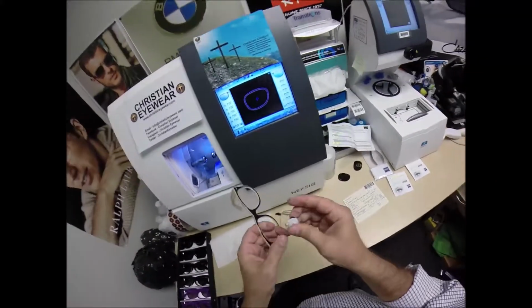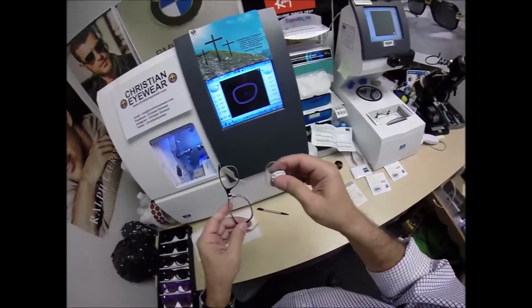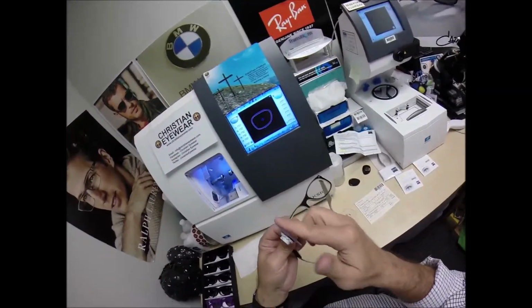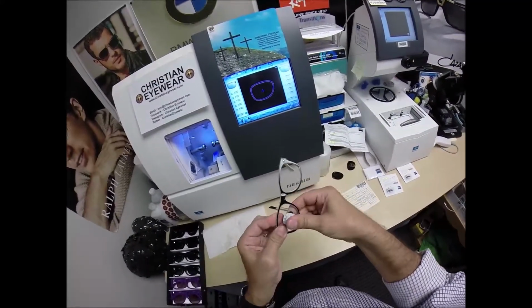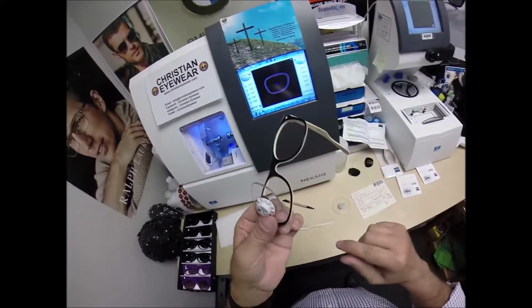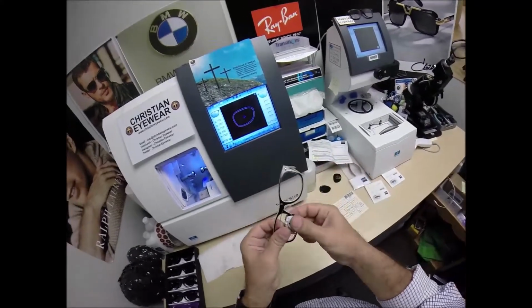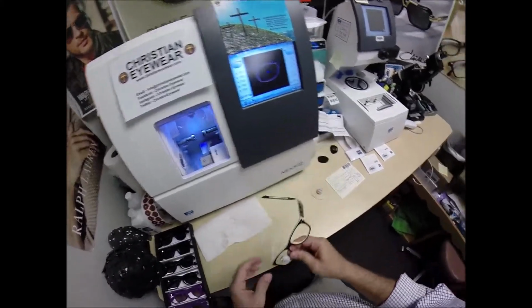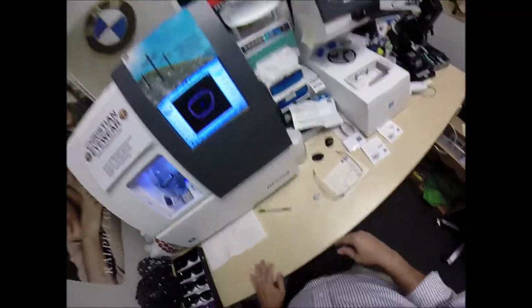Now, the reason why I put the safety bevel on the back surface of the lens: if this were too large, which I know it wasn't going to be, but on the 55 eye size it can be, I do not want any rough edges from the lenses coming in contact with the frame as I press down. If I felt it was too large, I don't want to scratch or mar the finish of the frame, so that's why I always put a safety bevel on the back surface of the lens, which you may refer to as the concave side of the lens. Only if you're one of these cool science kids.